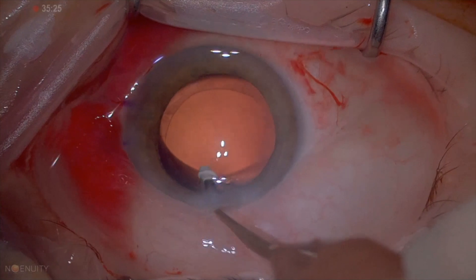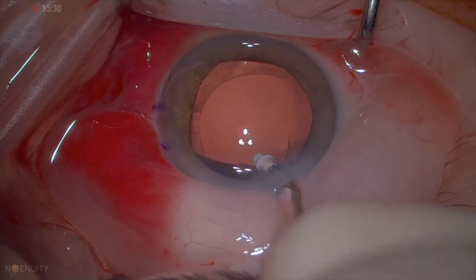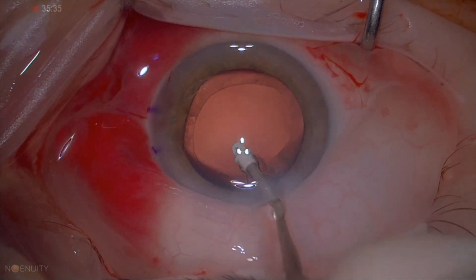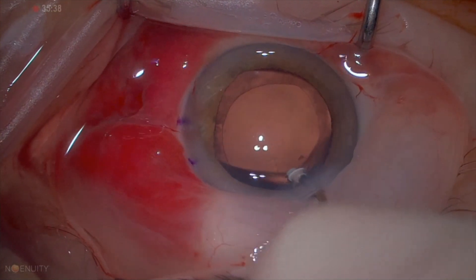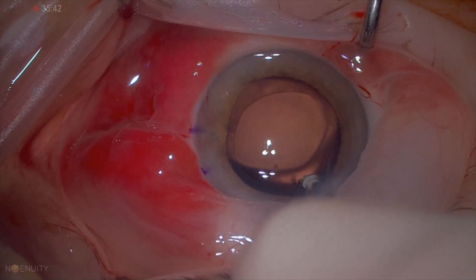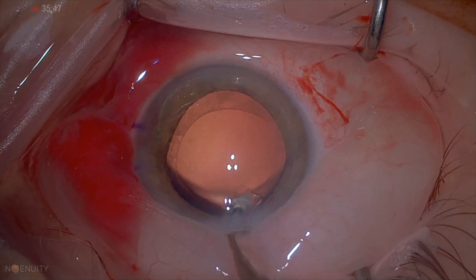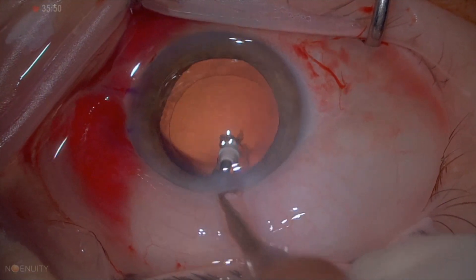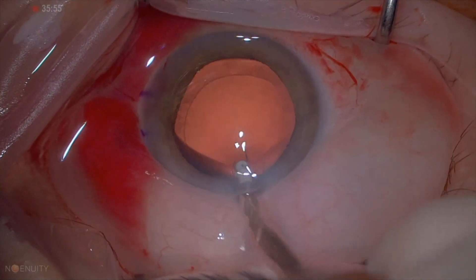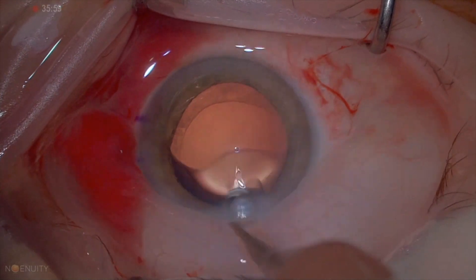Here, moving to the side, tucking under the anterior capsule, and then aspirating the sub-incisional cortex. This is one of the reasons why I personally do not like the coaxial IA and prefer the bimanual IA, which is very ergonomic and also eliminates the sub-incisional cortex problem.